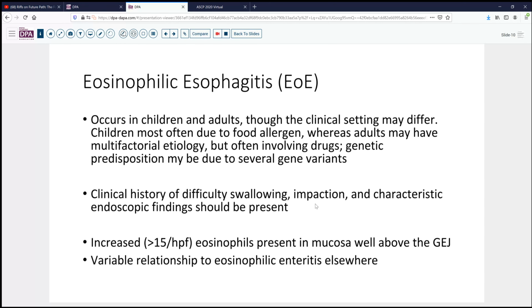What makes it even more so is if we begin to see eosinophils within the epithelial compartment as well. So be alert for that finding and aware that it may come in association. This more widespread eosinophilia may, again, be more likely to suggest a systemic rather than a specific contact association.